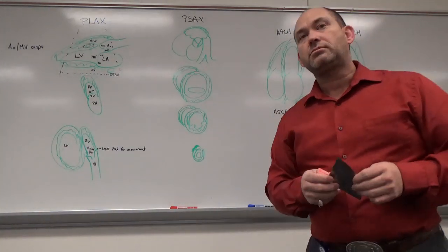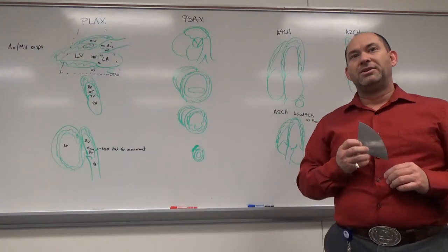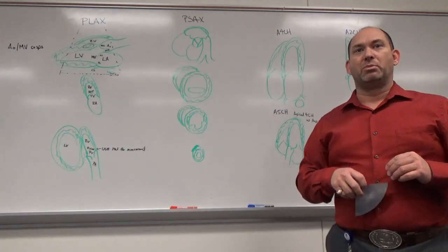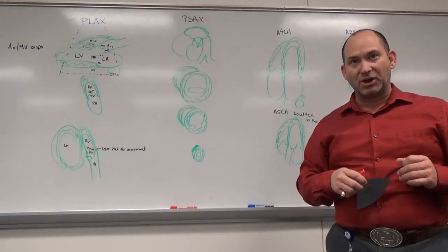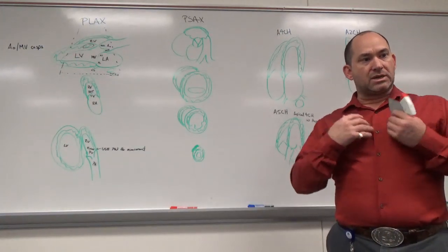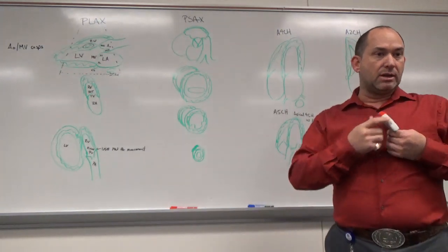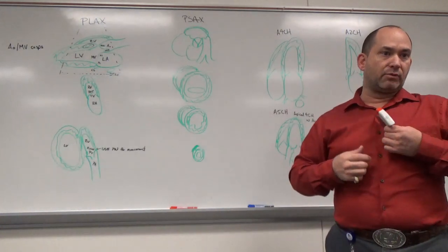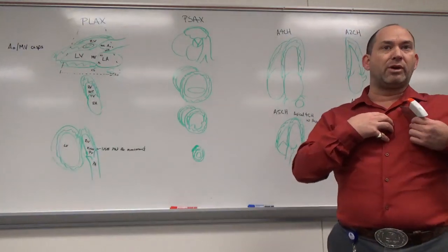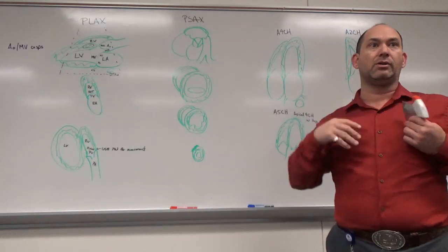Is there any specific way to have the patient breathe? I don't remember ever learning about that. It is very specific to the moment. So unfortunately, no. Generally speaking, in parasternal views, because you've got all this lung coming around the heart a little bit, we're fighting the ribs and the sternum, but if we get too far away from there, we're getting onto lung. Any lung comes in, a deep breath is just going to push that out.